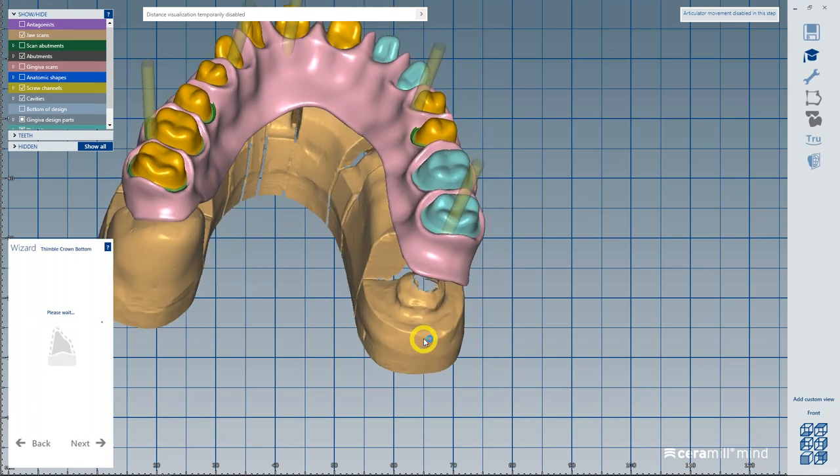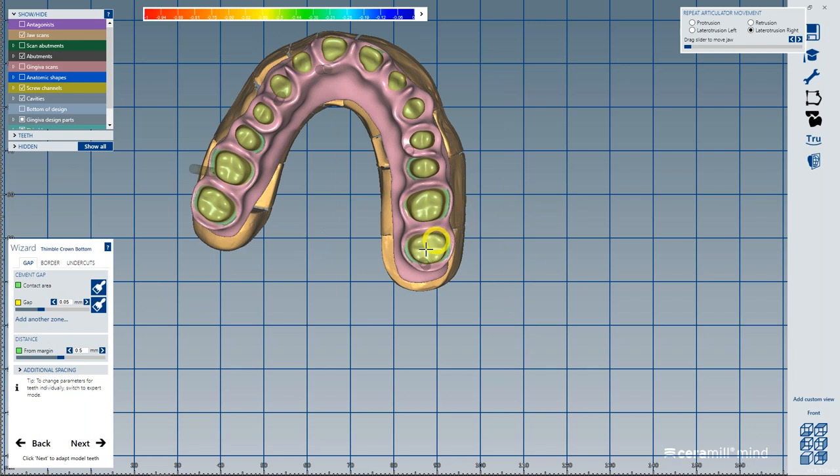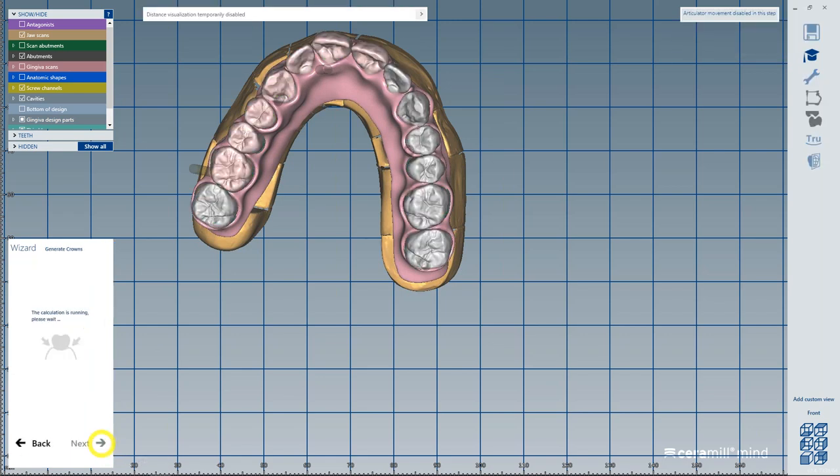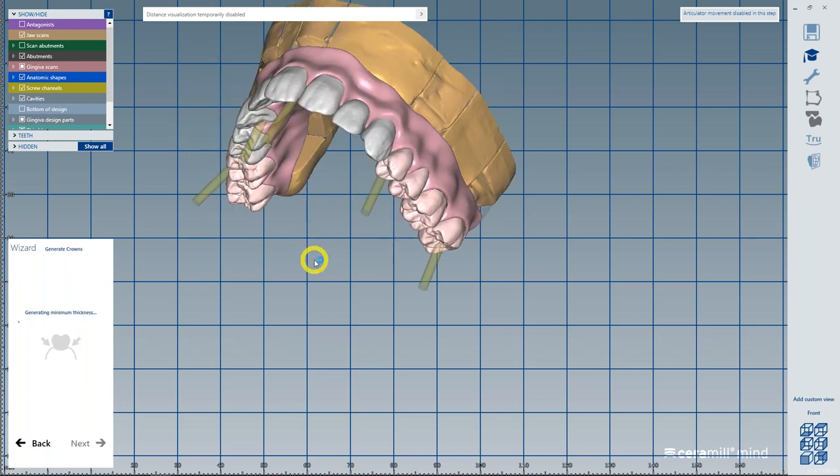As you see right here, this is going back to our single unit design, where now these are treated as crown bottoms. If you want to change anything, you can treat this like your regular single unit workflow by going through each step. It creates our crowns. Takes a little while, but remember it's basically making our crowns for us for a full arch, according to those positionings that I put in the beginning.